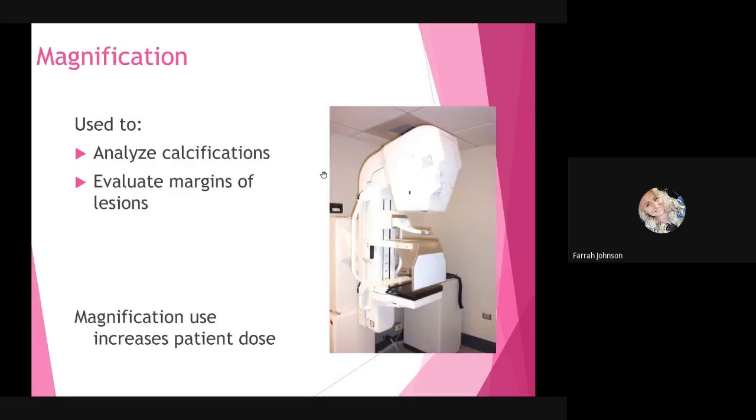Then we have magnification. So magnification views are very commonly used, especially for diagnostic reasons. They're used to analyze calcifications and also evaluate margins of lesions. Magnification use does increase patient dose, so that is why accurate patient positioning is imperative.